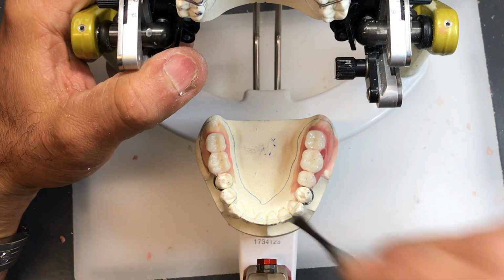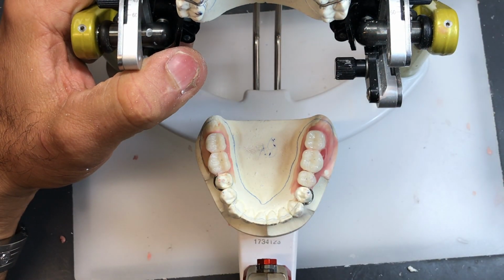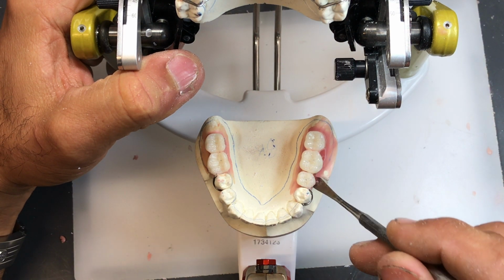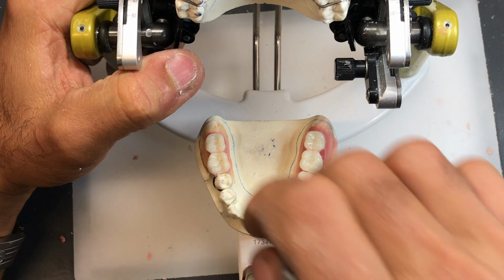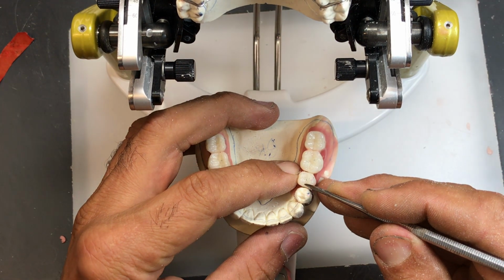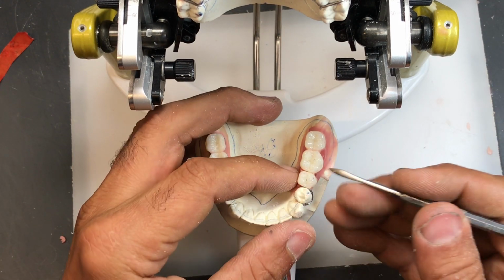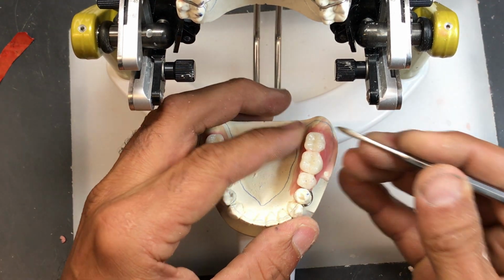And then I'm just going to go back while I'm here and soften up the wax around the 5 and rotate it a little bit if I can, and try not to move the wire. Remember, there's a wire underneath there that you've sealed down. And I'm going to push it and see if I can pivot that like that, and make sure there's no gaps in between.